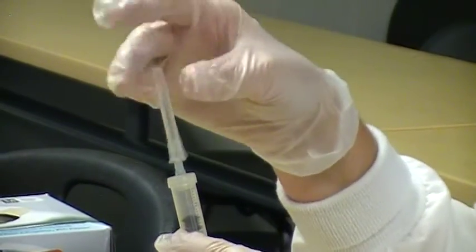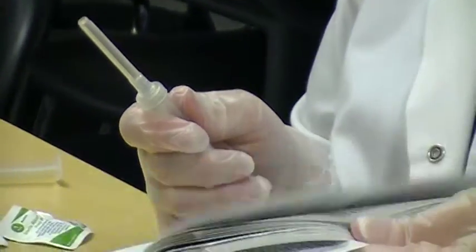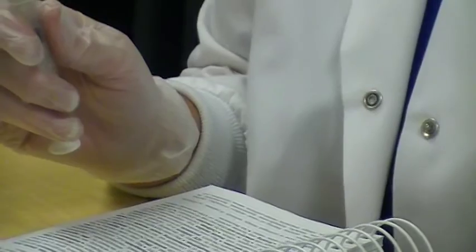So I have my 1 milliliter of medication. Again, we're going to use the drop method to put the top back on. If we have pulled this up in the med room, then we want to make sure that it's covered. If we look up furosemide or Lasix in our drug book, it will tell us how fast to give it. And we want to do this before we go into the patient's room so that we appear to know what we're doing when we're talking to patients.